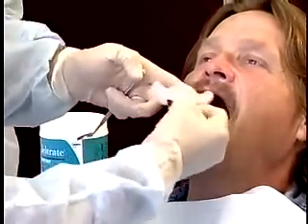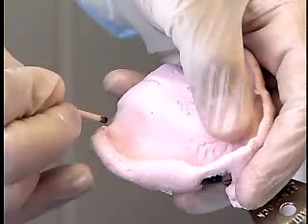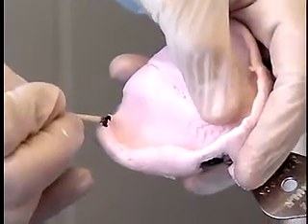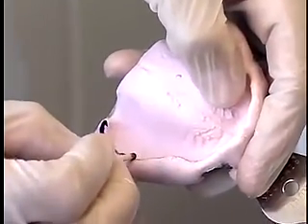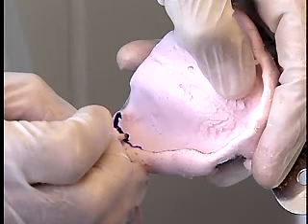Remove the impression from the mouth. Inspect the impression to determine if it is acceptable. Disinfect the impression using current recommended surface disinfectant for 10 minutes in a sealed bag prior to proceeding to the lab. Alginate impressions tend to be overextended, so the denture outline should be drawn on the impression with an indelible stick. This outline will be transferred into the cast and will be helpful to fabricate the custom tray.